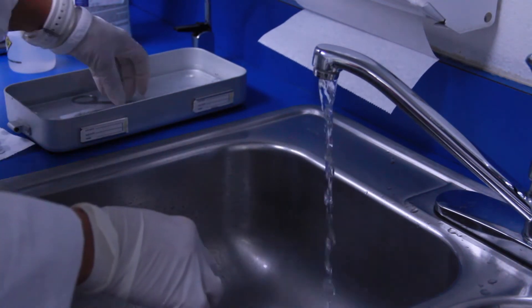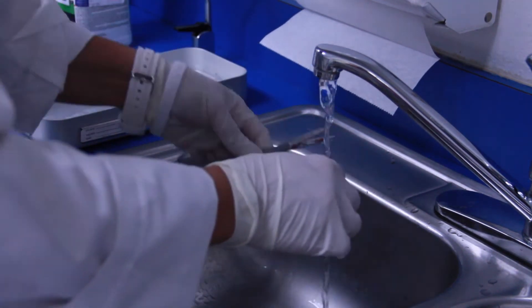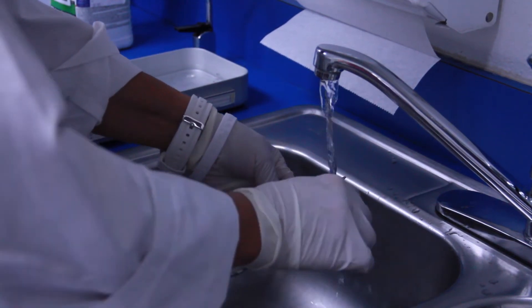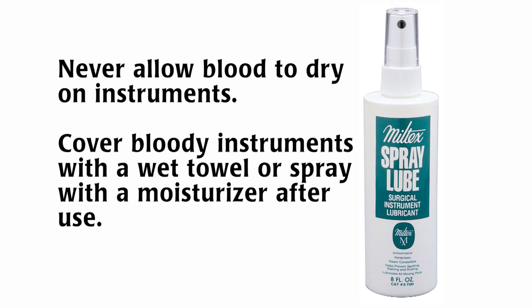To prevent blood from drying on instruments, simply saturate a towel with tap water and lay it over bloody contaminated instruments. Spraying the instruments with a moisturizer is an effective way to prevent blood from drying.